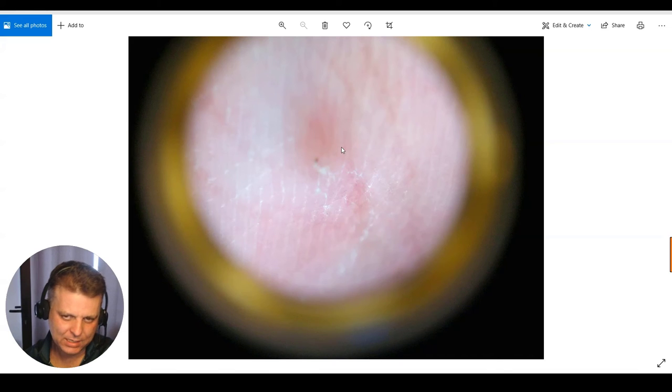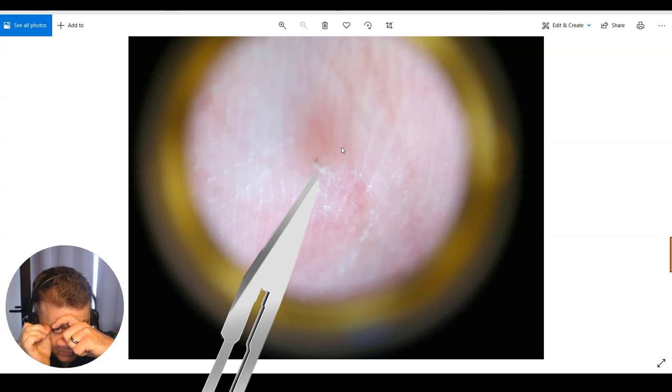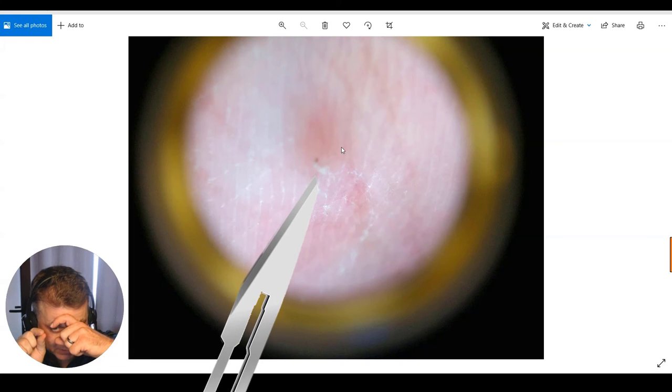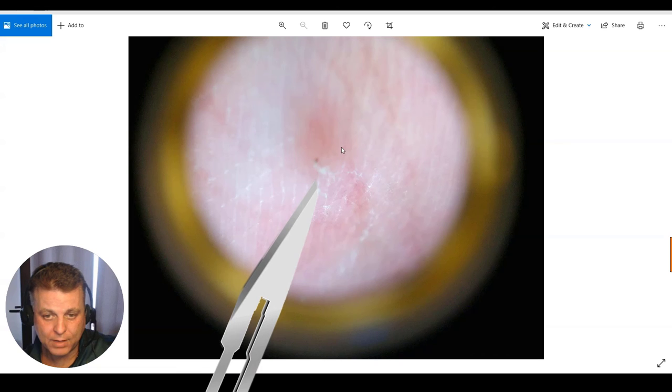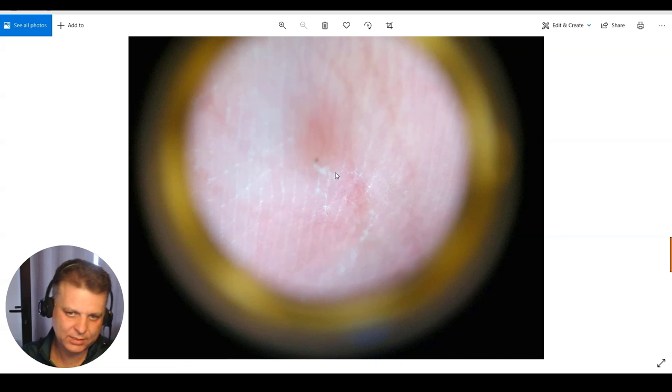It's nice because if you have decent hand-eye coordination, one of the things that it would help with when you do go to a KOH — you can actually, in one hand, hold your dermatoscope, and then with the other have a number 11 blade, and you can use your visualization of where the blade tip is going to very accurately lift that mite out of there and perform the KOH that way. But really, if you're seeing this in the dermatoscope, you're going to be dealing with scabies.